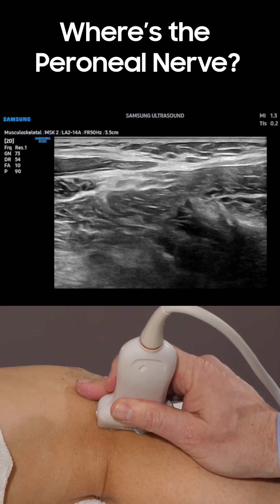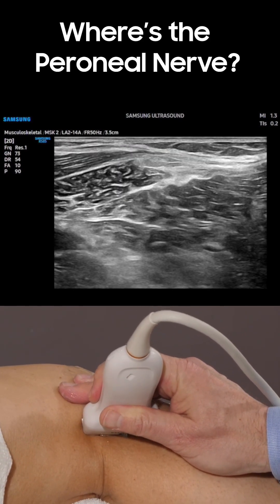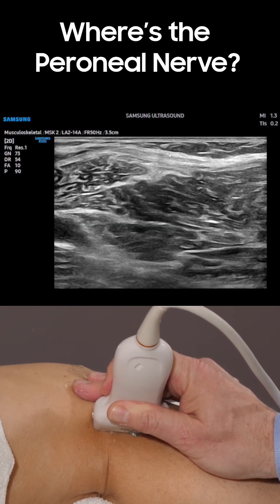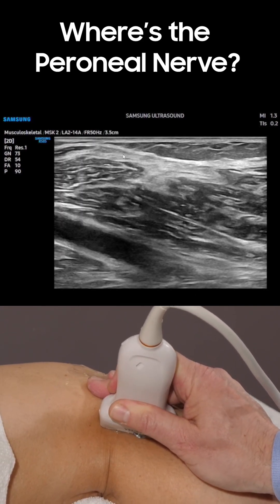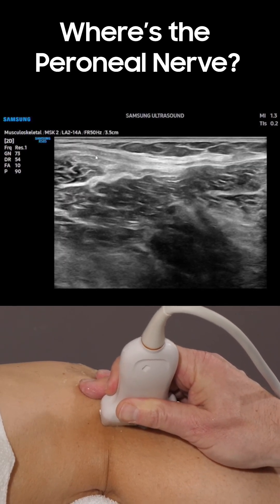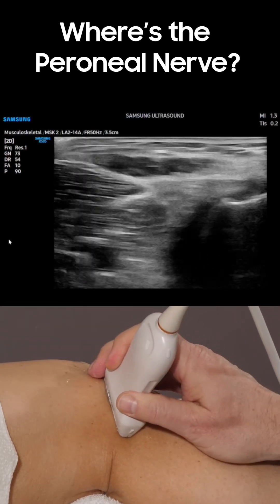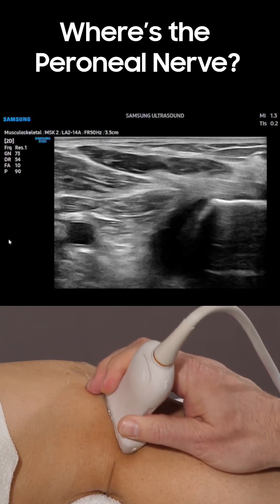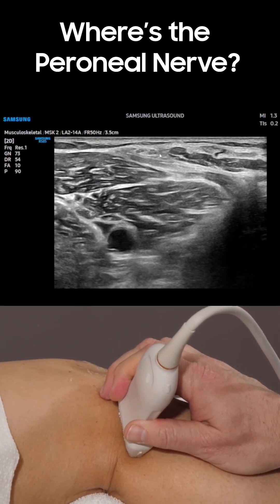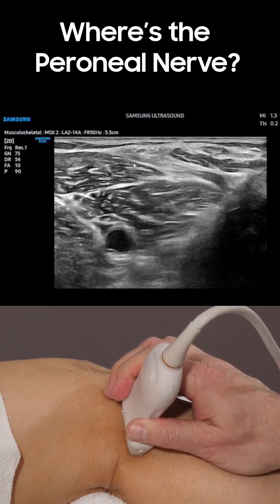Here I'm showing it right here. But as you can see, it's more difficult to identify in long axis because it blends in with other fascial planes. That's why when looking for peripheral nerves at the upper and lower extremity, the short axis is really the key to identify the tubular nature and the honeycomb appearance of a normal nerve trunk.